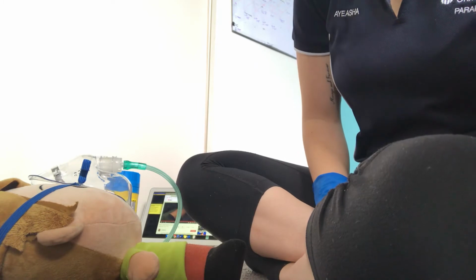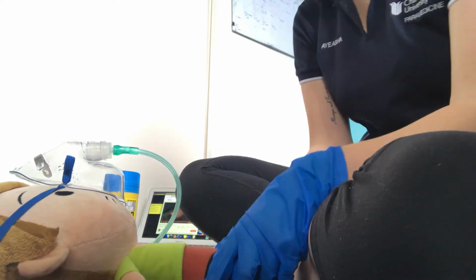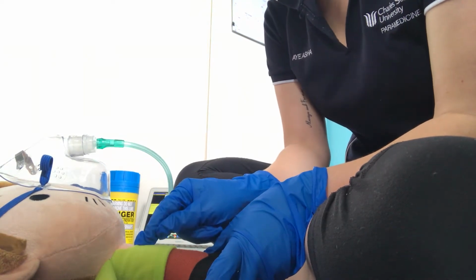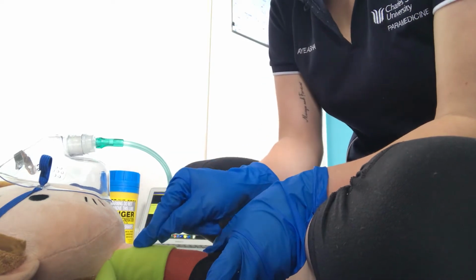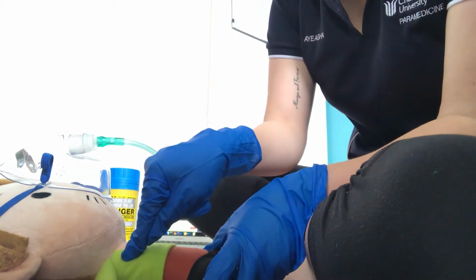And so what we're going to do, we're going to expose the patient's chest, and we are going to make sure that we have found the site. So what we're going to aim for is the second intercostal space down on the anterior chest, and I'll do it on this side, and the midclavicular line. So we're going down 2 and moving over to the midclavicular line.